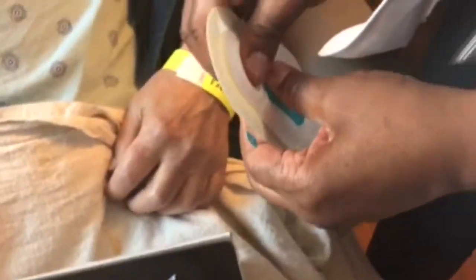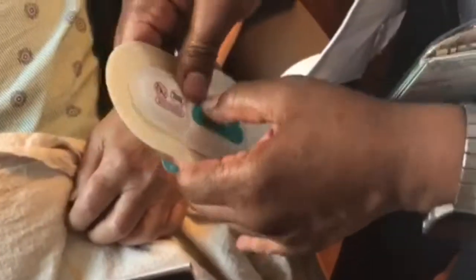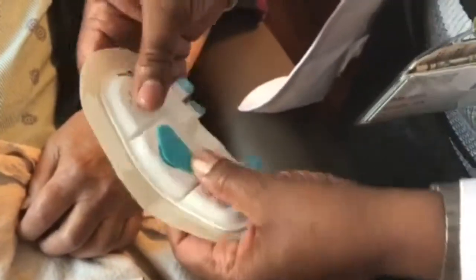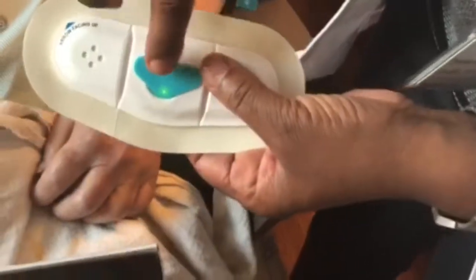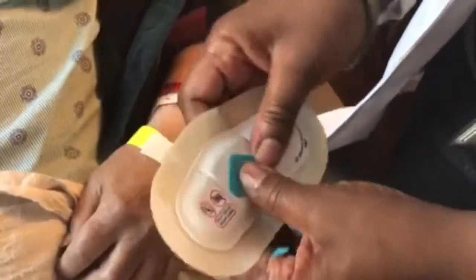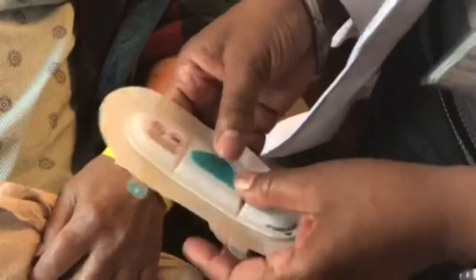You fit it in the way it's shaped and it might be a little hard to get in — you have to manipulate it to get it in. Once you get it in, you'll know it's connected when the green light comes on. It won't stay on, but as long as you see that green light, you know that you have the connection.